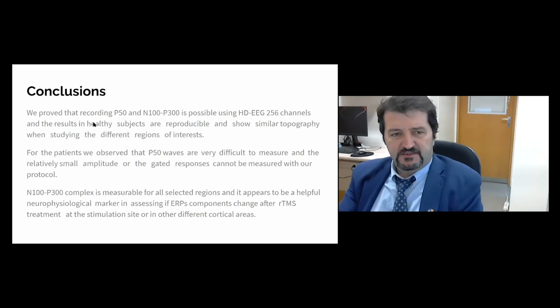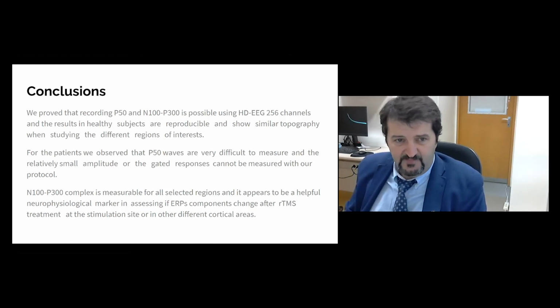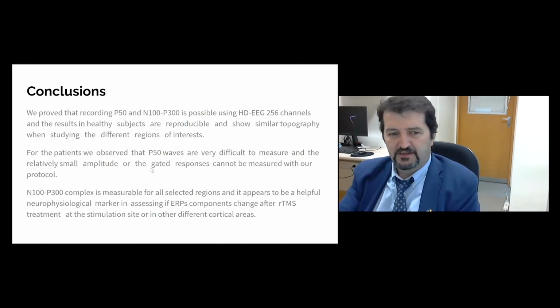So with this study, we proved that recordings of P50 and N100, P300 are possible using high-density EEG with 256 channels, and the results in healthy subjects are reproducible and show similar topography when studying the different regions of interest. For the patients, we observed that P50 is very difficult to measure. This is a very, very small component. And N100, P300 might be suitable to be measurable in these regions.